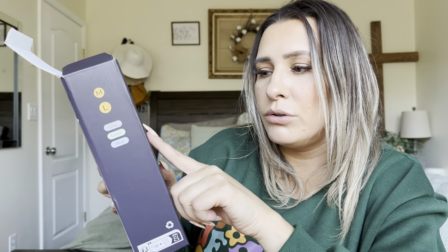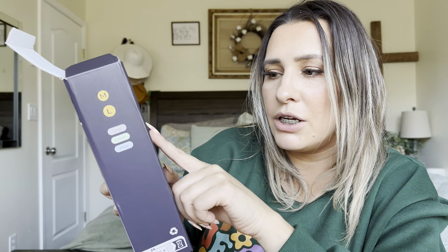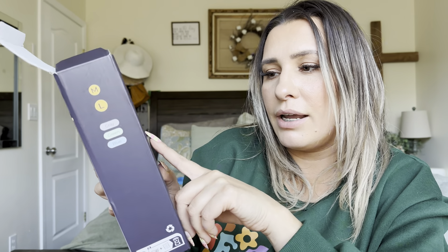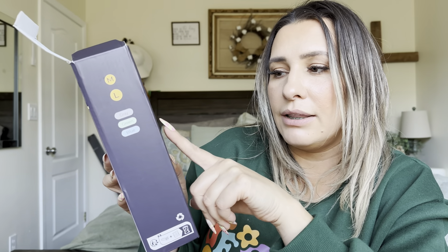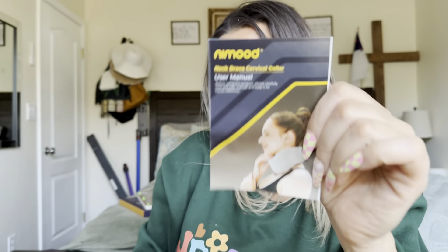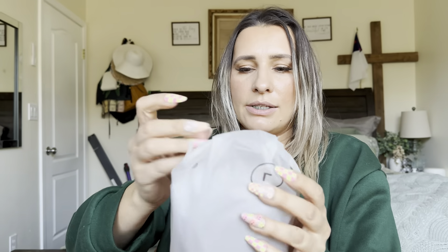Some of its claims: it helps relieve cervical spine sprains, soreness, it assists in post-operative rehabilitation, it limits neck movement, supports the neck, and it effectively lessens snoring. It does come with a little user manual that tells you how to clean it and everything like that.